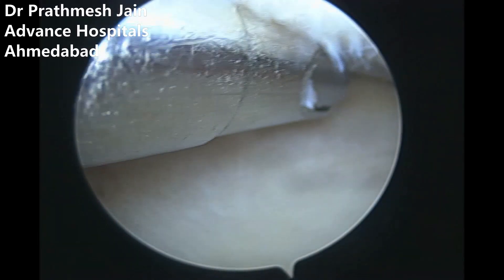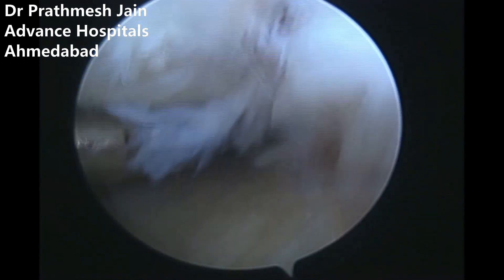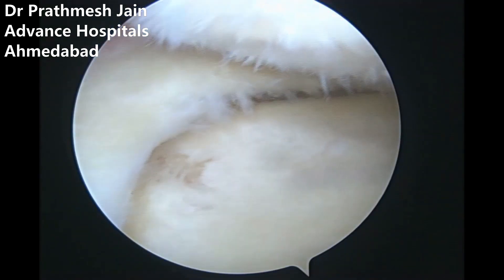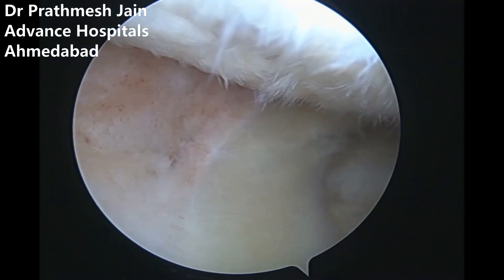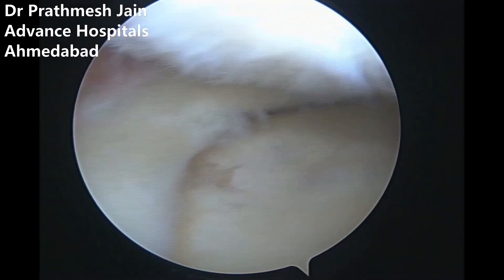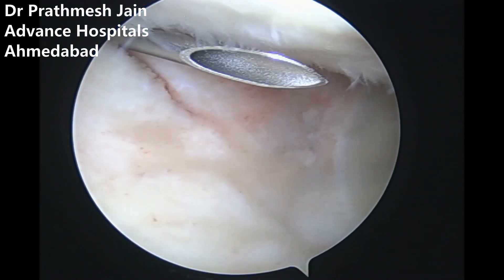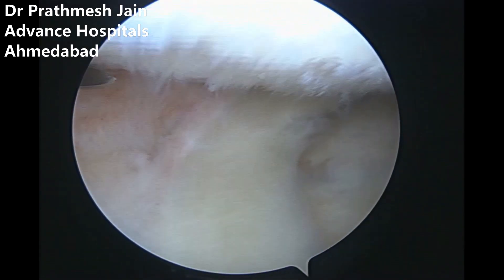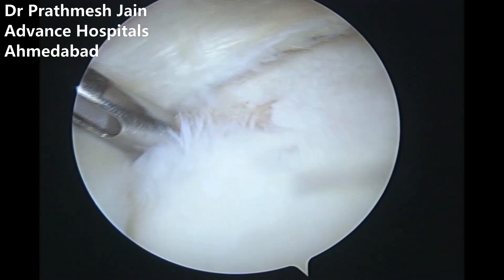This is a unique surgery. When we go in with an arthroscope, we will see that there is cartilage loss on the anteromedial aspect of the tibia, corresponding to femoral cartilage loss as well. This is because of a non-functional meniscus which is extruding out because of a root tear. There is a root tear on the posterior part of the knee and the meniscus is extruding from the anterior part, leading to anteromedial chondral loss on the tibia — essentially the initiation of arthritis in most of these cases.